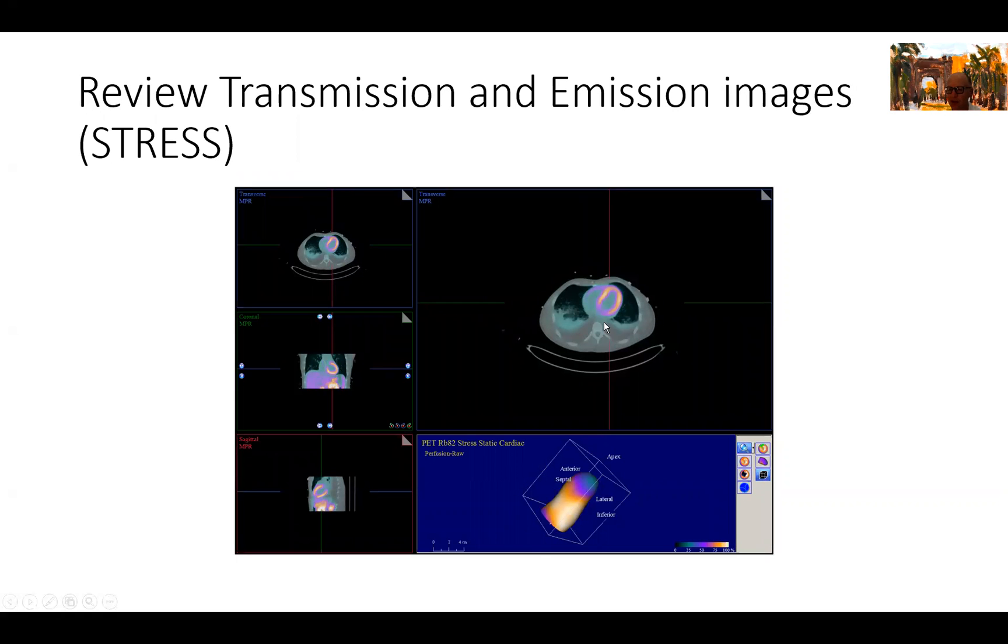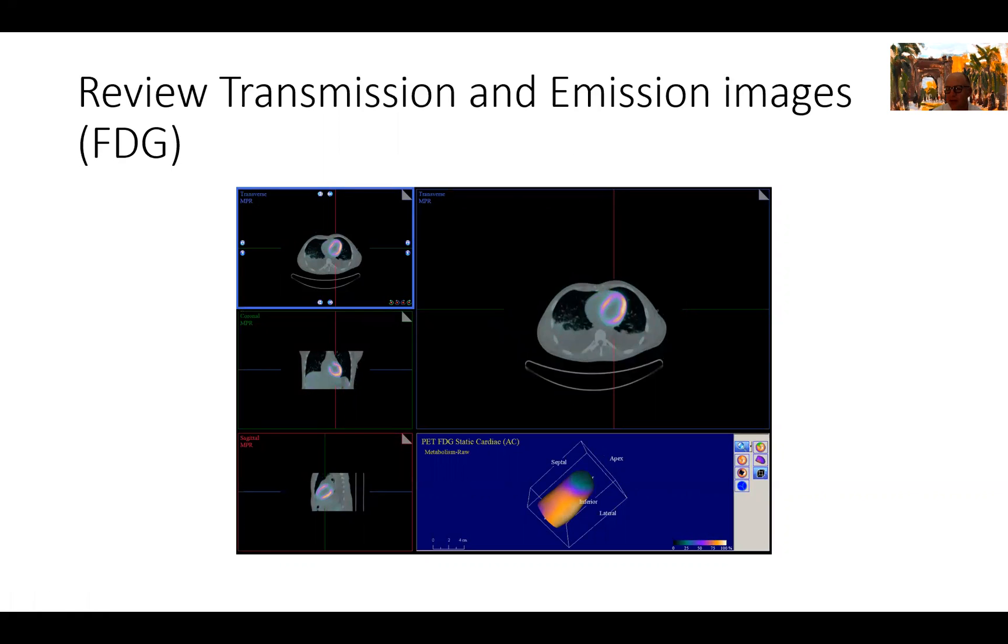We go to the stress images. Similarly, we interrogate the registration of the perfusion images with the CT images and ensure that they're properly registered. Finally, we do the same exercise for the FDG images as you can see here. We can look at them in short axis images or cross cuts across the heart, and then we can look at them transaxially, in the sagittal plane, the coronal plane, and the transverse plane as seen here in the magnified view.